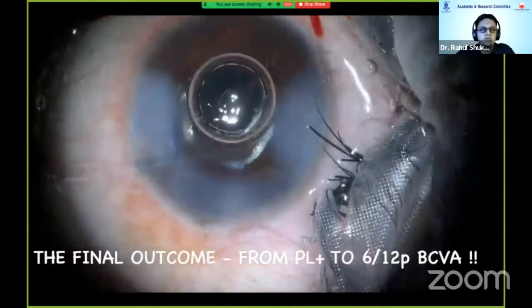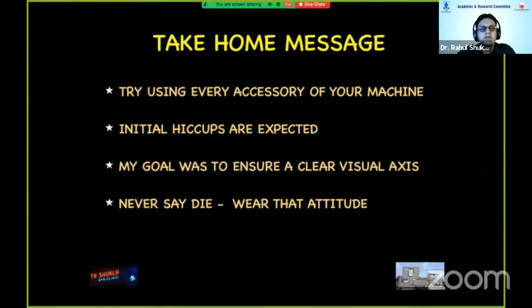So my take-home message is, try using every accessory of your machine. Initial hiccups are expected, and never say die. Wear that attitude.